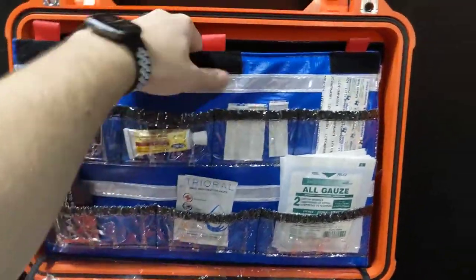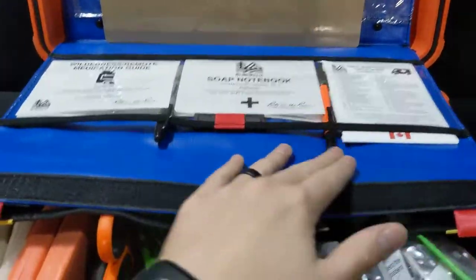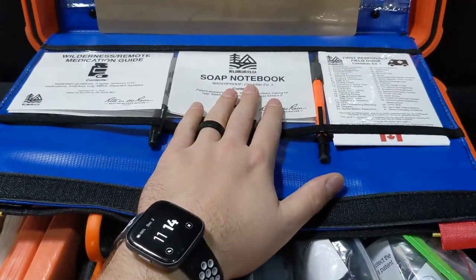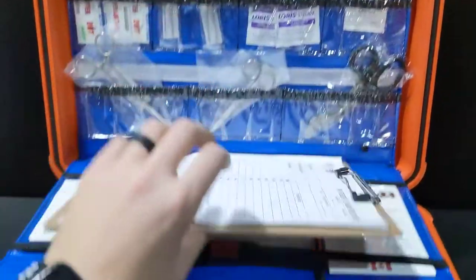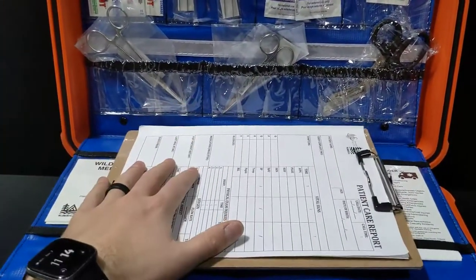The back has a second layer of organization — this just pulls down. It has a big flap that's great for guides. We've got a medication guide, a SOAP notebook for writing patient information, a fold-out guide, and writing utensils all stashed there. There's also a full clipboard with patient care reports that stashes right there out of the way.